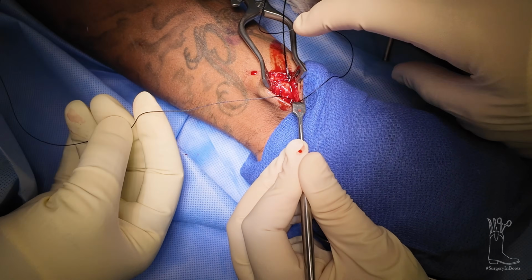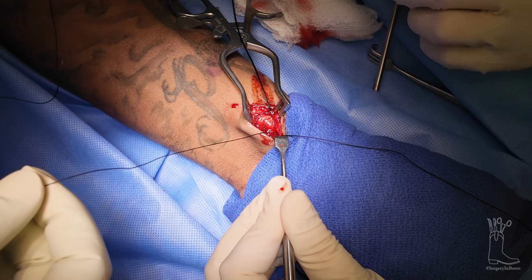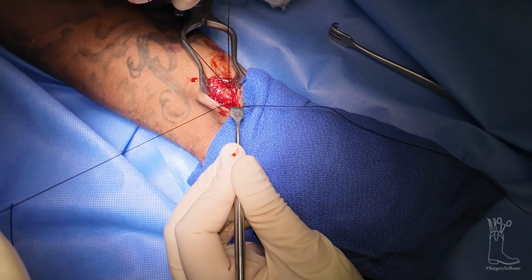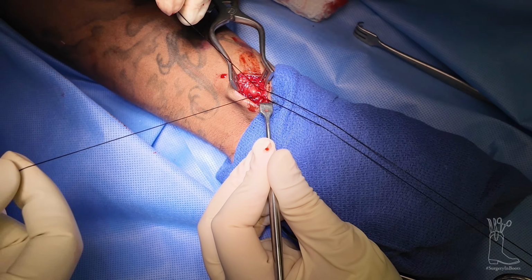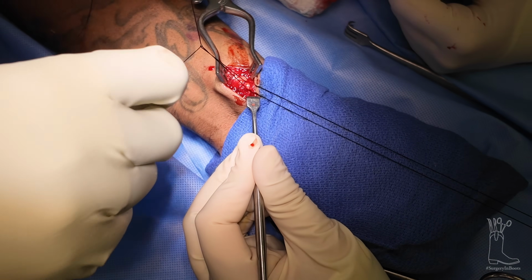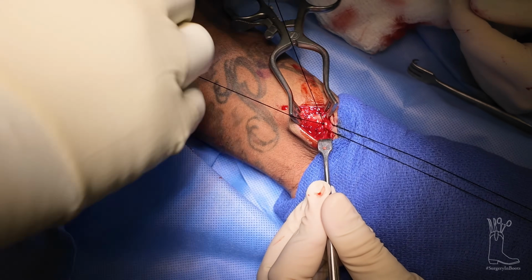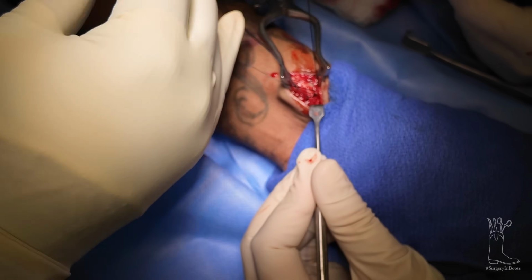So Sally, grab out one. Right, pull one of yours. Just separate, pull it, grab it. So whose is whose? Mine. So you take that one. This one's mine. So we just ligate it here. So I'm just ligating this one, and ligate this one as well.